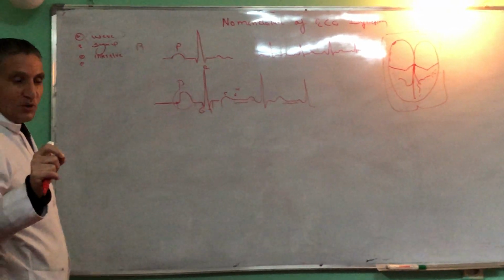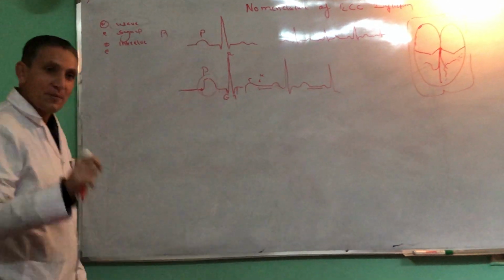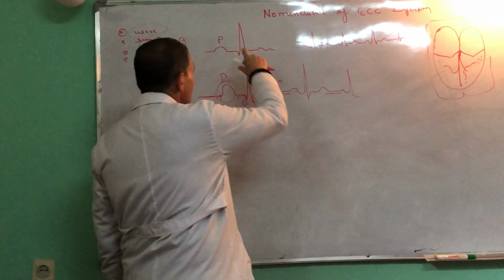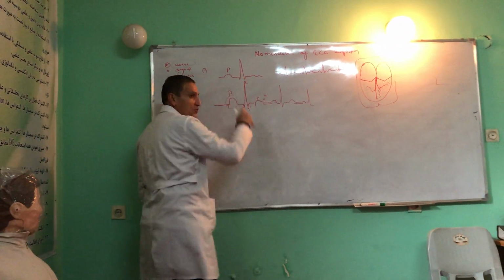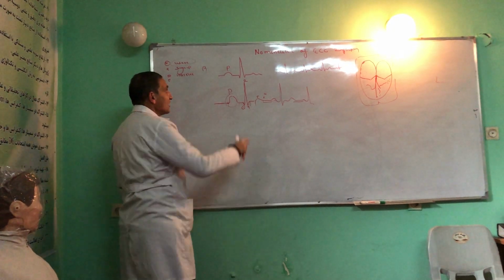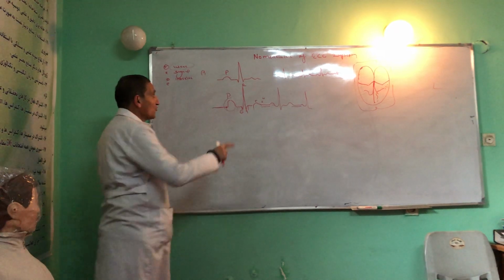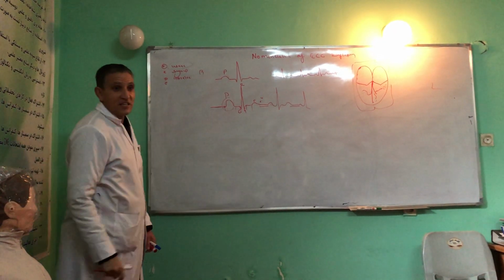So the atrial depolarization is produced by slow conduction, while ventricular tissue is supplied by Purkinje fibers. Purkinje fibers have fast conduction, so the ventricle contracts fast, and the wave produced by this ventricular contraction captures the repolarization wave. Therefore we see atrial depolarization, but we don't see repolarization.